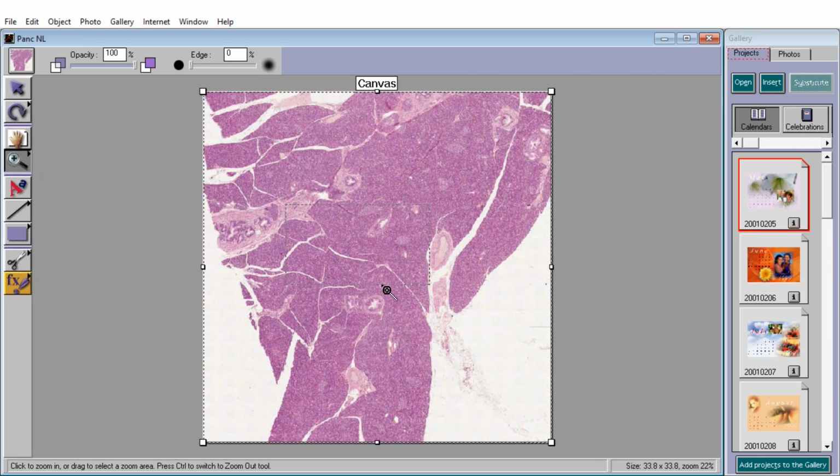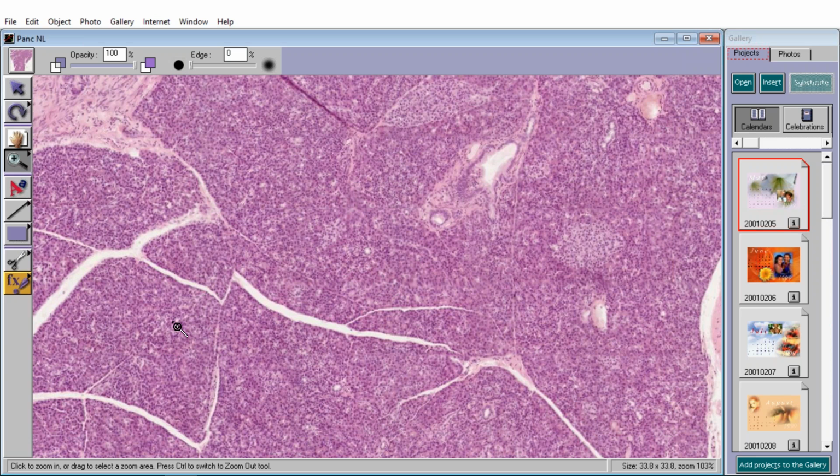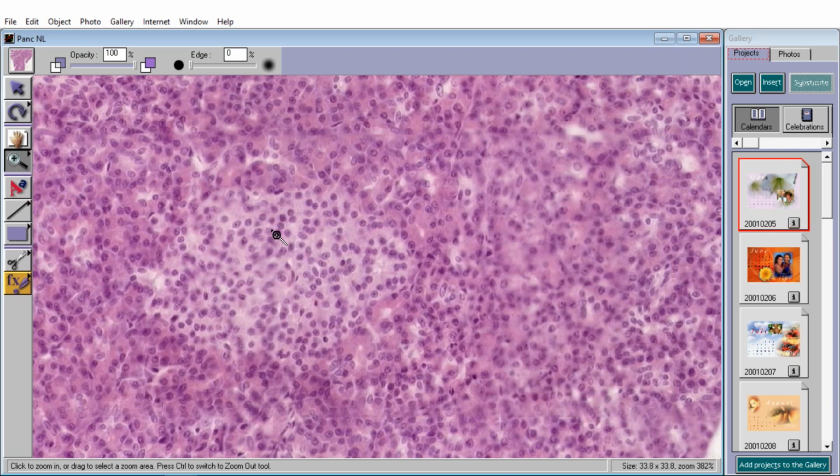You might say, well, how do you know this is not a salivary gland rather than a pancreas? Because you also see these little round areas that do not look like they are exocrine. They look like they are just vascular, but they don't have acini. So that's islets of Langerhans. So does a pancreas look like a salivary gland, like a parotid gland, let's say, with the exception of having islets of Langerhans? Yeah. So this is the world's most beautiful and normal pancreas.